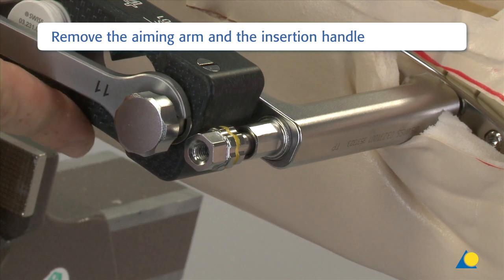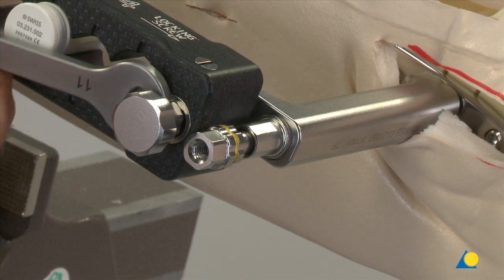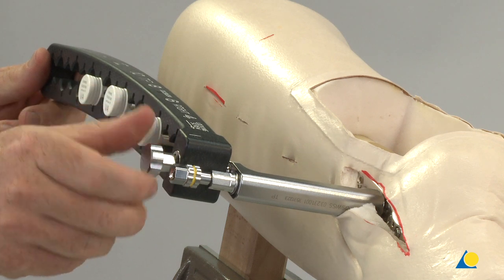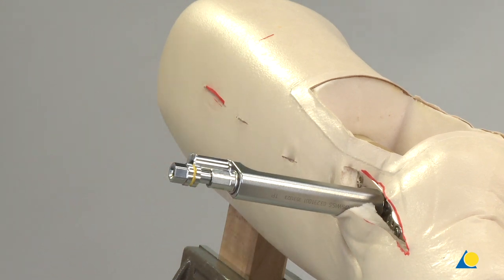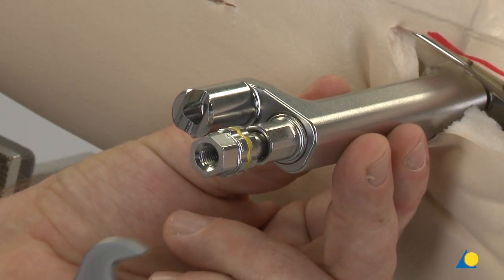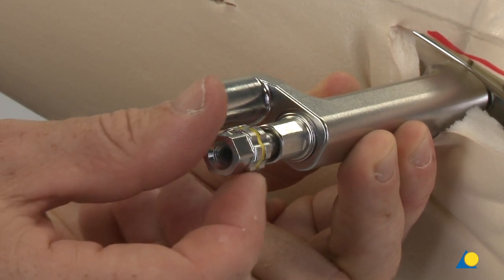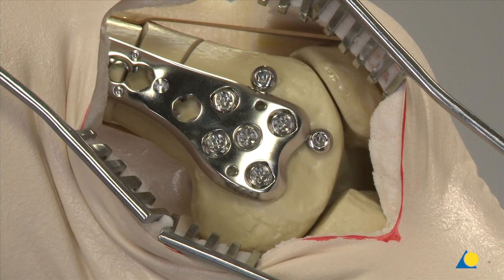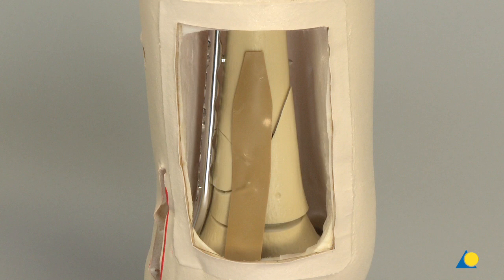Loosen the connecting nut of the aiming arm with the combination wrench and remove the aiming arm from the insertion handle. Loosen the locking bolt with the combination wrench and remove the locking bolt and the insertion handle. It can be seen that the plate is correctly placed on the condyle and that the plate bridges the multi-fragmentary metaphyseal region.